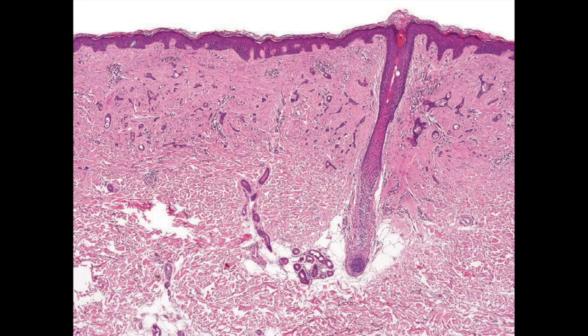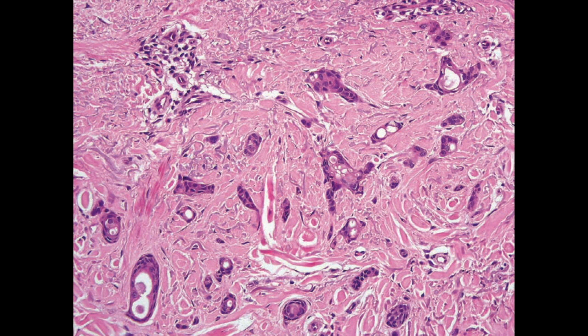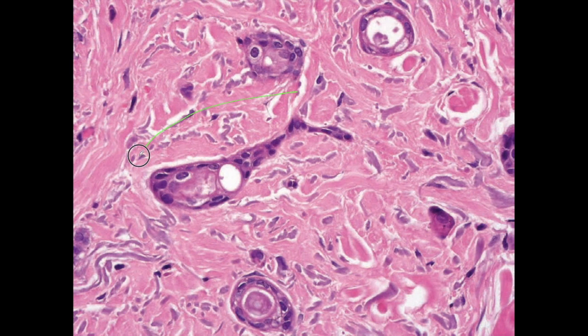microscopically, syringoma is a benign ductal differentiation in the superficial dermis. It never goes into the subcutaneous tissue. And the lesion is symmetric and well demarcated. At high power, we can see epithelial strands and small cysts in a dense sclerotic fibrous stroma. Here is the tadpole-like structure we can see in syringoma, MAC, DTE, or morphiform BCC.